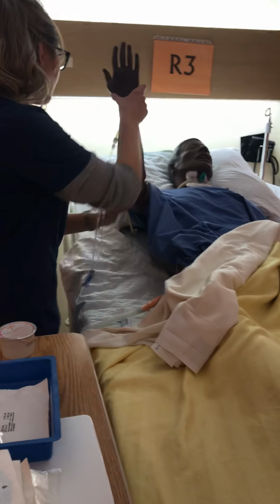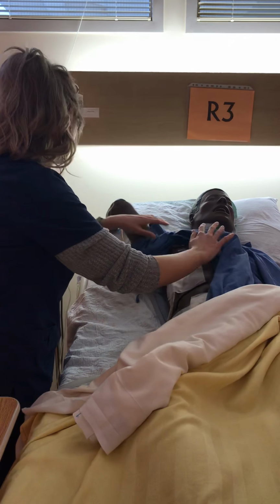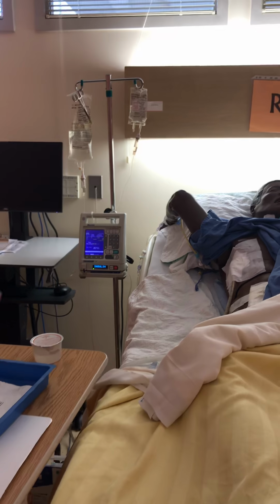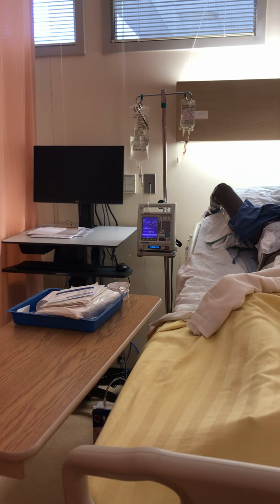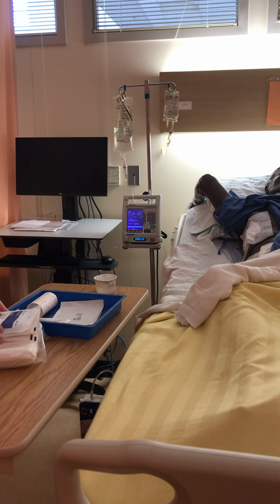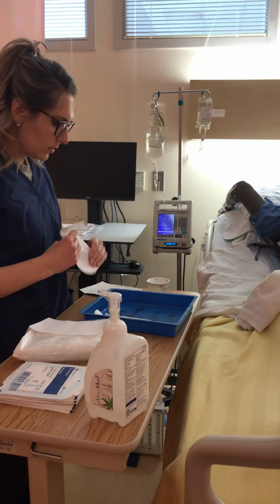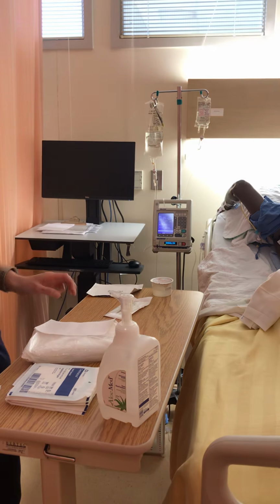Okay, so now I'm just going to get my patient in a comfortable position. He has the right to refuse, he does not. So we're just going to get you comfortable here, okay? All right, so he is feeling comfy. I have that chest tube exposed. Okay, we'll just move that over here. And I'll grab my hand hygiene bottle, and just get everything ready.